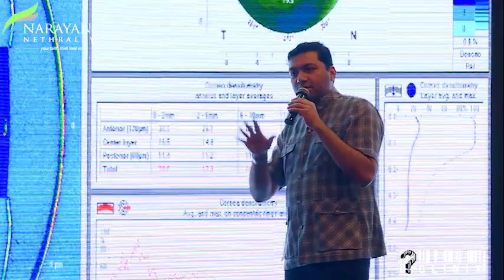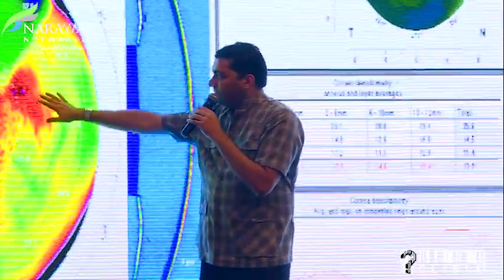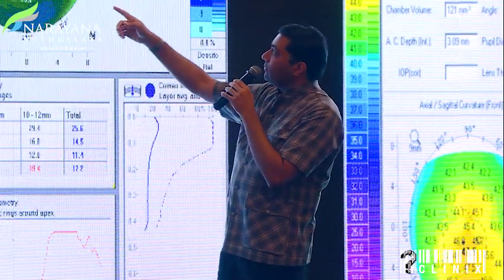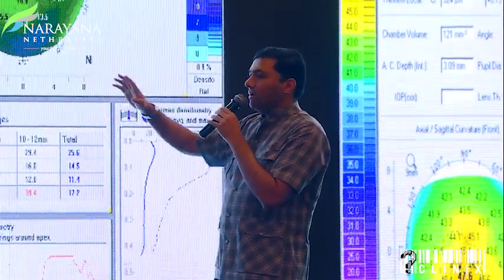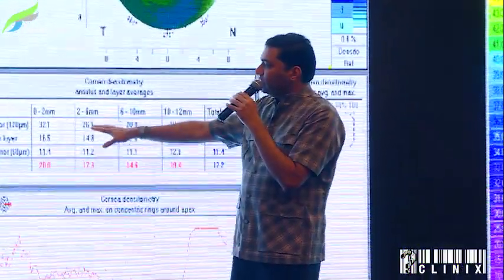When you talk about flattening or getting a good outcome, the major issue of measuring is the haze. A lot of people have not used this in the Pentacam. You can start from the beginning and scale it. Let's forget for the moment how reliable and repeatable it is; there are enough papers on its repeatability issues.